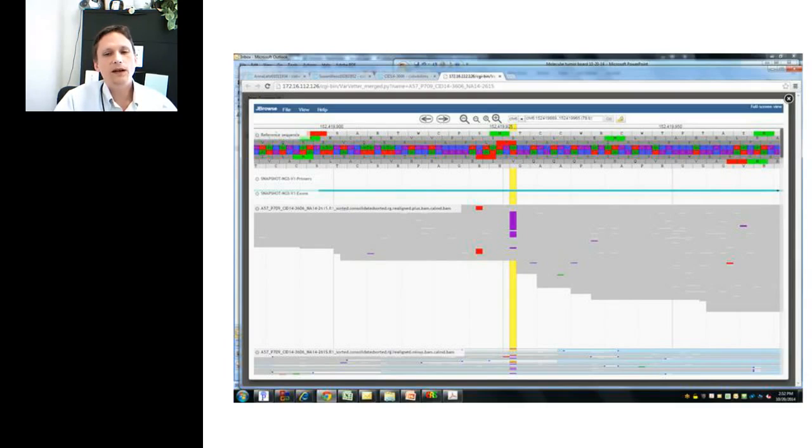And if you don't remove duplicates, what do you see? Well, let's say we have in this pileup 200 reads. We have 2 variant calls here that look real, a red one and a purple one. The red one, there are probably about 10 to 20 reads in that little clump here and 10 to 20 reads in that clump. And interestingly, if you look out to the ends, you can see these clumps all start and stop at the exact same place. So while we had, let's say, 40 reads out of 200 showing this mutation, we actually know there are only 2 mutant reads. And that's a very different sensitivity and a very different level of confidence in the clinical lab, knowing you only have 2 reads.